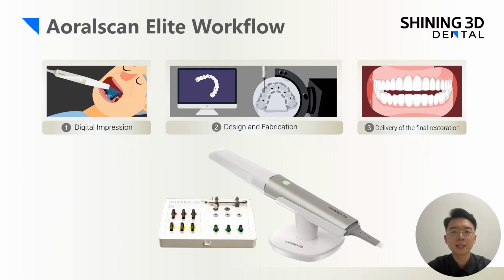Using Aoralscan Elite, you can efficiently complete the data acquisition required for full arch implant restoration cases, then send the data for design and fabrication, or perform chairside printing or milling of provisional restorations for immediate loading cases. It is an entire digital workflow with standardized protocols, ensuring seamless integration into the existing workflow and addressing previous challenges with digital integration solutions provided by Aoralscan Elite.